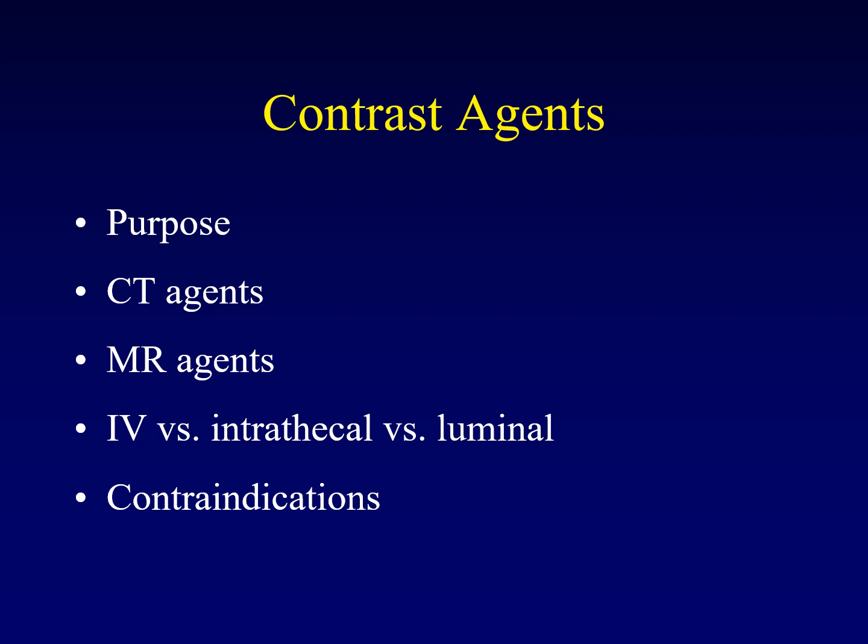For example, we most commonly use this in the setting of intravenous contrast, where we inject a contrast agent into the bloodstream. We can see where that contrast agent goes, and we know which areas are receiving the most blood flow.